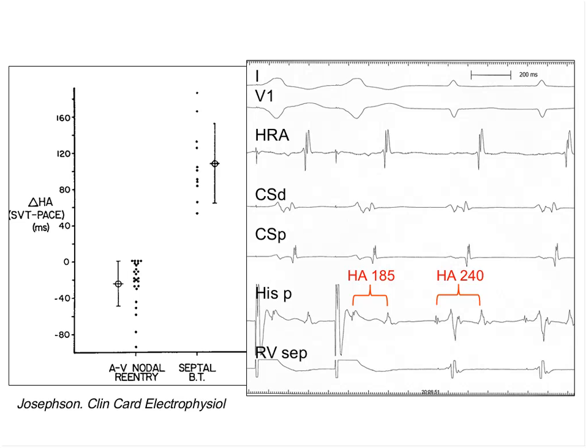Or sometimes the tachycardia appears when we are introducing the catheters, and the catheters are not in stable places yet. So I think that these maneuvers have their role, absolutely, in some situations, and as you said, particularly when the activation sequence does not help.